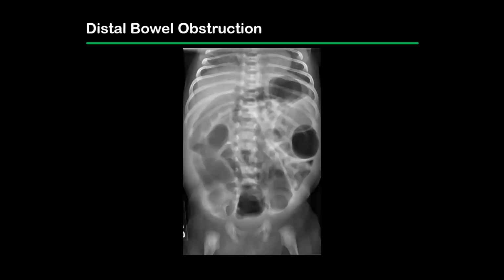This is an example of a distal bowel obstruction in a baby. When we're thinking about proximal or distal to the ligament of Treitz, we see there's a whole lot of bowel gas that's dilated in this baby.